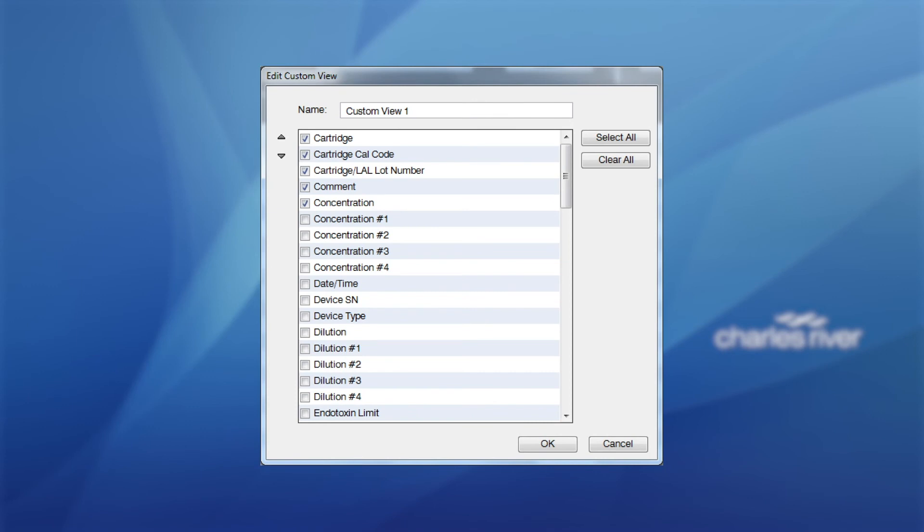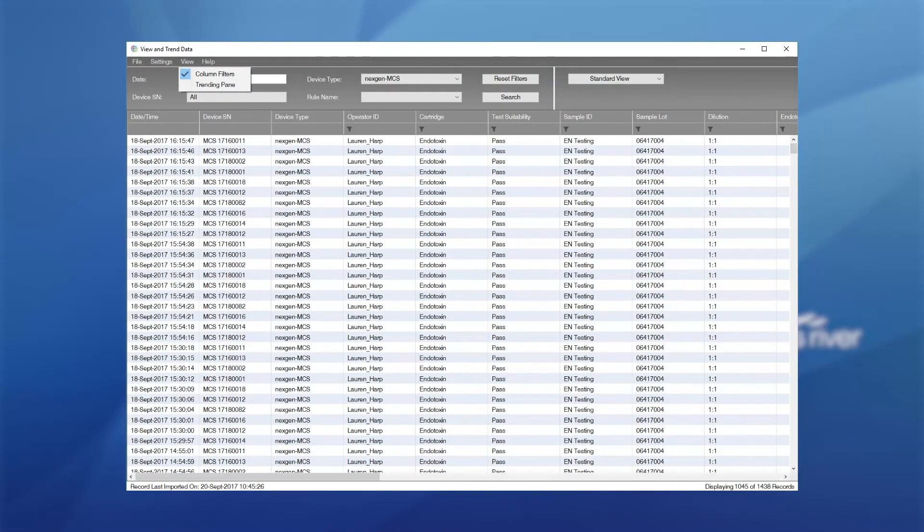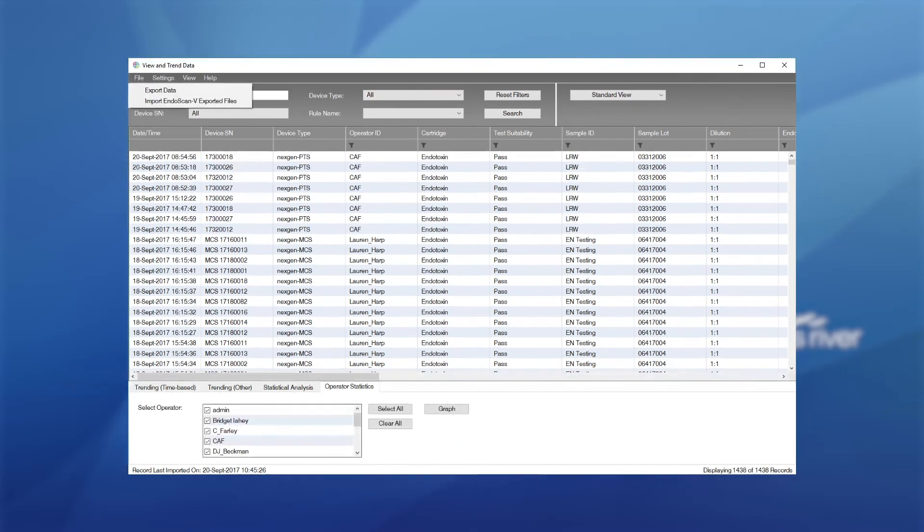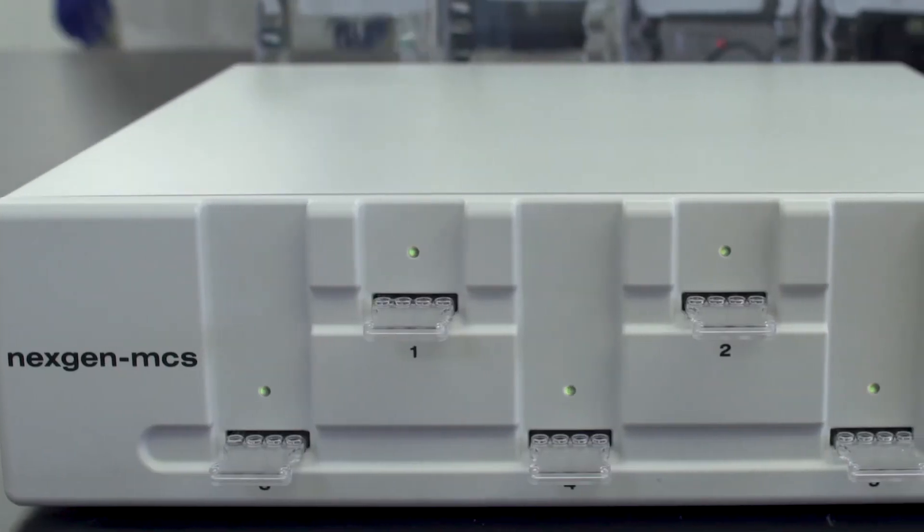Users can also use the trending pane by clicking on view trending pane. Under the trending pane, users can produce multiple graphs depending on their requirements. Once completed, the filtered data can be exported from Cortex by clicking on file, then export data as a CSV or XML file, which can then easily be uploaded to a LIMS. It's as simple as that.